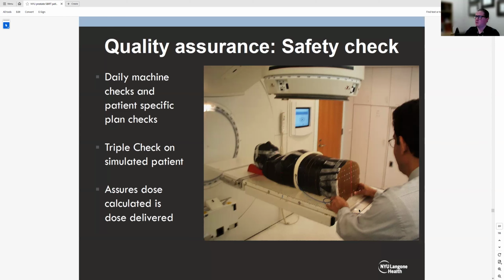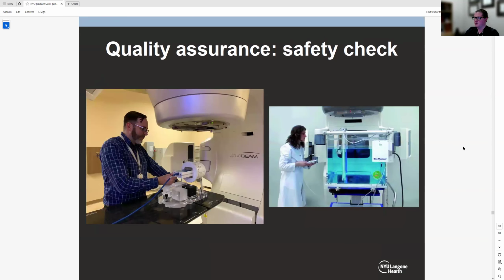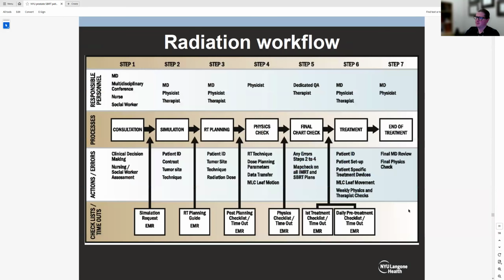And so there's a lot of quality assurance that takes place before a patient will get into the room and actually get the treatments. You can see a lot of different machines are used, different water phantoms and calculations that are done before anybody goes into the room. So a lot of safety is performed. You can see this is another way to look at all the different checks and safety checks before the patient will even get on the treatment.